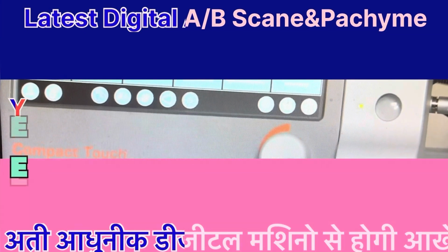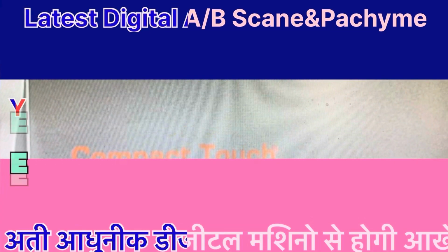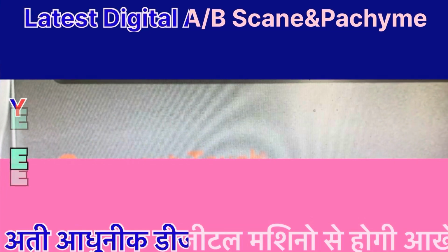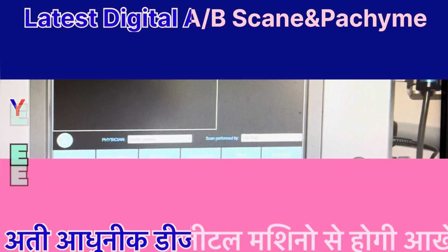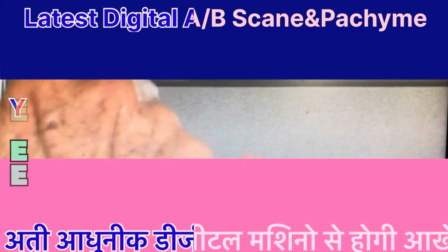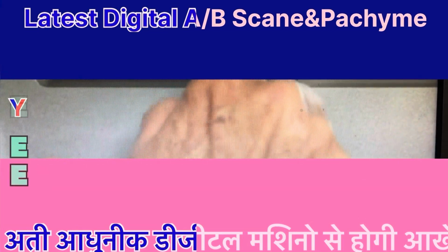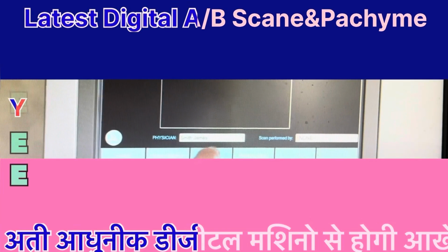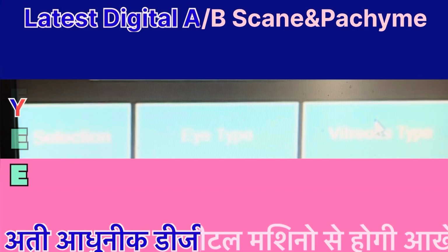Once a patient is selected, the examiner can enter 2 keratometry values for each eye. For patients who have had corneal refractive surgery, IOL calculation can be more complex. Selecting refractive allows the examiner to enter additional parameters that may help determine IOL power in these cases. Touch the biometry icon from the bottom menu to activate biometry mode and display the examination screen.